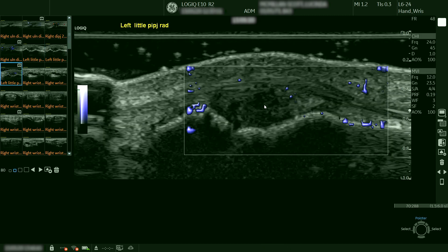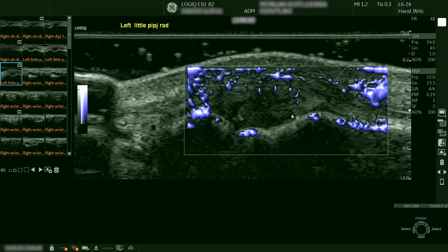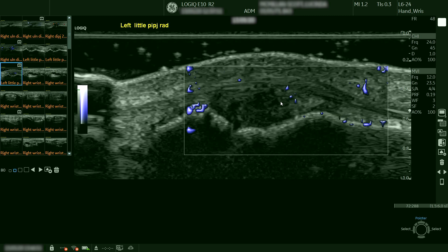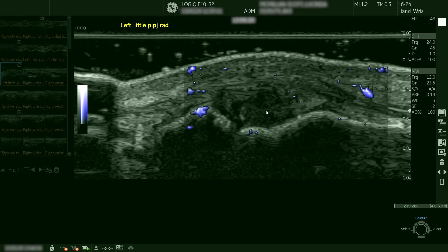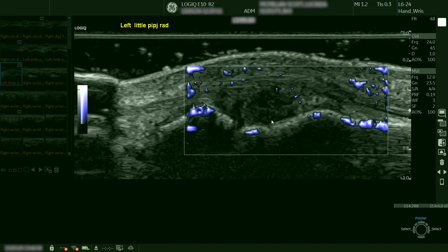But with the MVI application with radiant flow we can see large areas on the edge extending into the synovitis, so there is vascularity present.